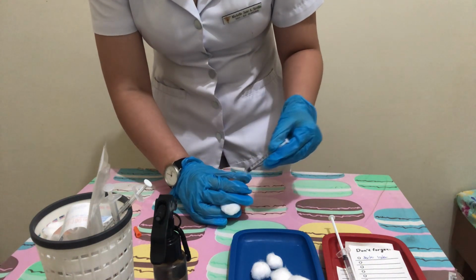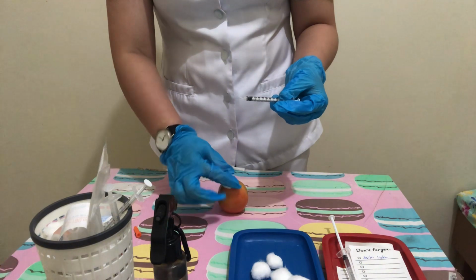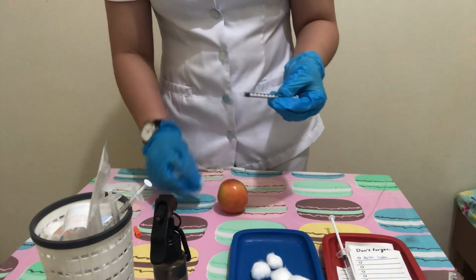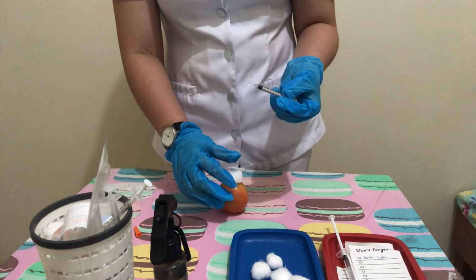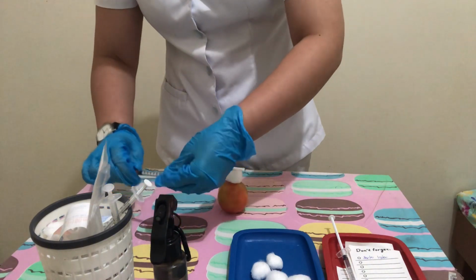And then quickly withdraw the needle and then place the swab on the site and apply gentle pressure, but don't massage the area. So if bleeding occurs, apply pressure to the site with a dry sterile gauze. Now assist the patient into a comfortable position and then flip the medication ticket.